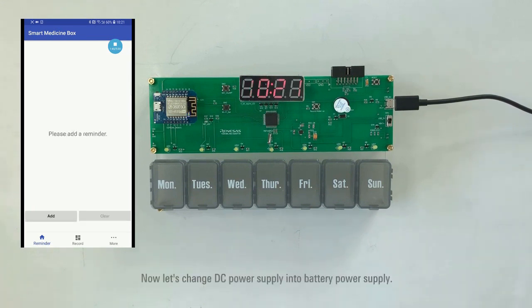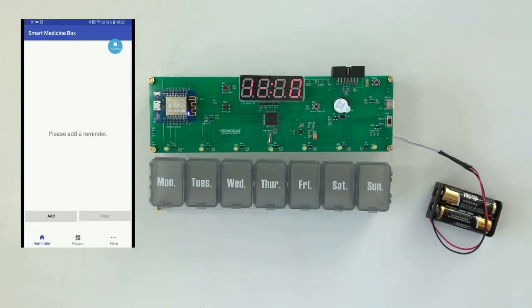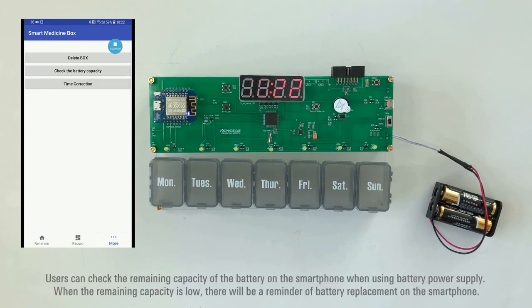Now let's change DC power supply into battery power supply. Click on the Time Correction button on the app to synchronize the time with the medicine box. Users can check the remaining capacity of the battery on the smartphone when using battery power supply. When the remaining capacity is low, there will be a reminder of battery replacement on the smartphone.